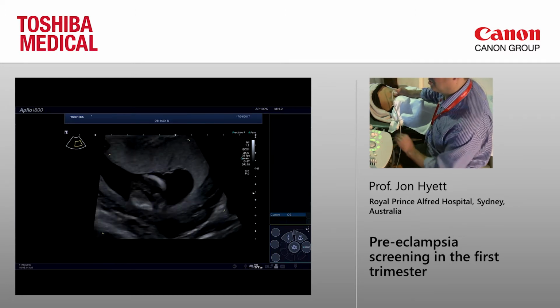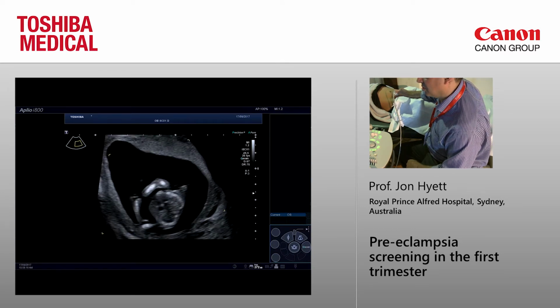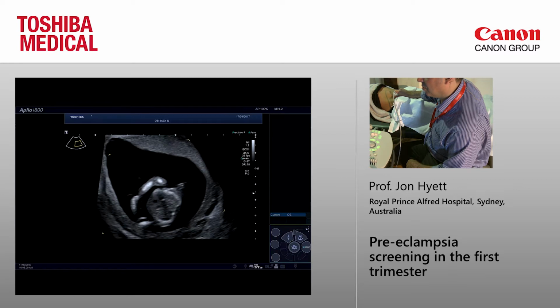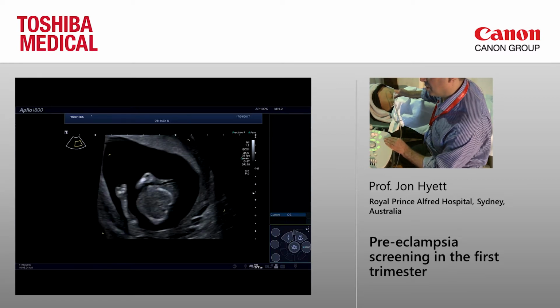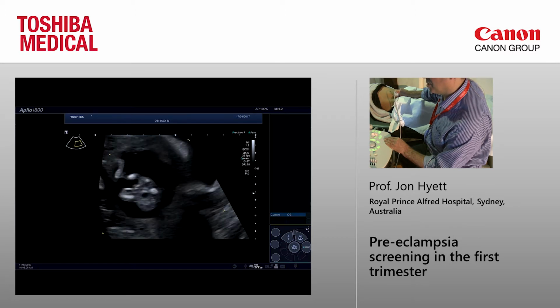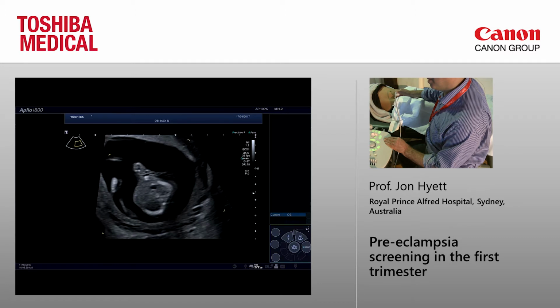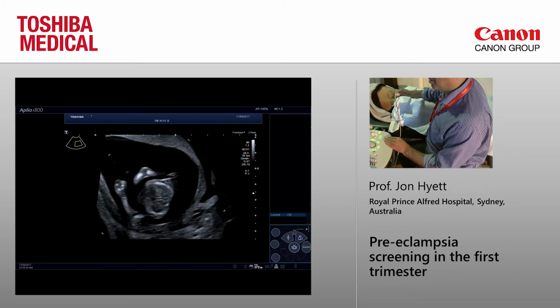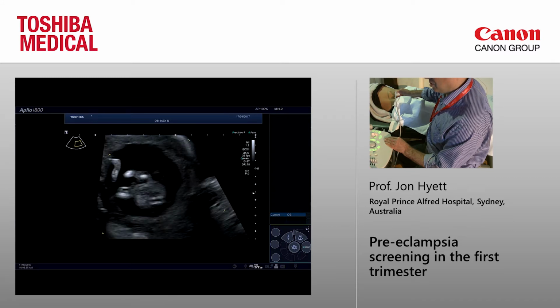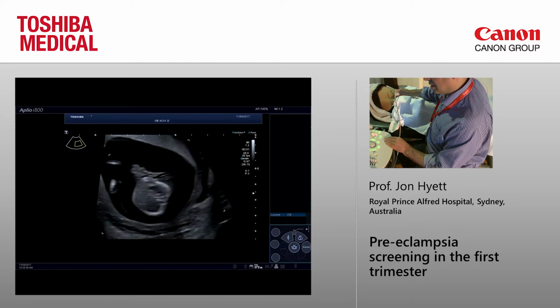And just as I scan through quite briefly, you can obviously see the chest here, you can see the four-chamber view. And we've got the two arms and hands out front, working our way through. We've got the two legs down the bottom end there. Just coming back for a moment, you can see the stomach below the level of the heart, so that's nice. And you can see the abdominal wall looks intact as well.